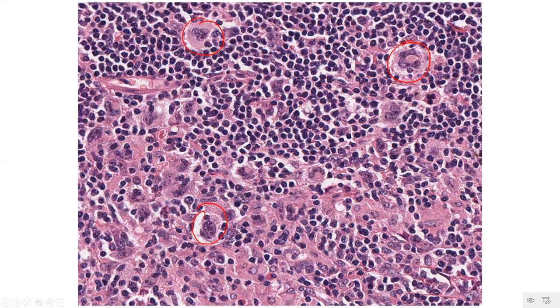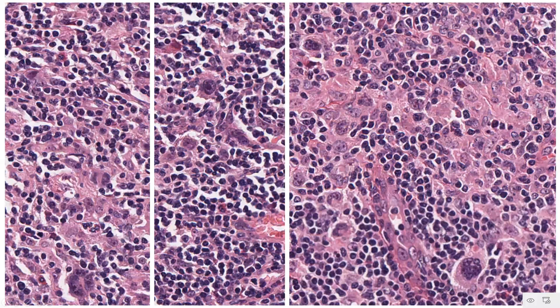It might not be easy in some cases, like, for example, the syncytial variant of nodular sclerosis or the lymphocyte-rich subtype of a nodular pattern. So you have more areas where you see these classic Hodgkin-Reed-Sternberg cells. Observe the third picture where you see a large multinucleate cell, but with the same kind of prominent eosinophilic nucleolus. So even these large multinucleate cells are variations of Hodgkin-Reed-Sternberg cells. They should be counted within the Hodgkin-Reed-Sternberg family. You could go around on a Hodgkin-Reed-Sternberg cell spotting spree with these slides, quite a few of them for you to identify.